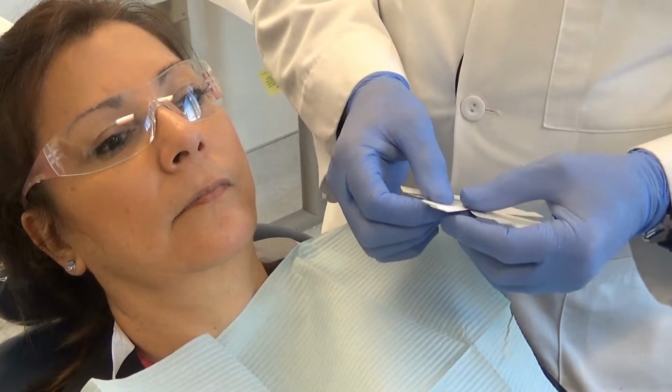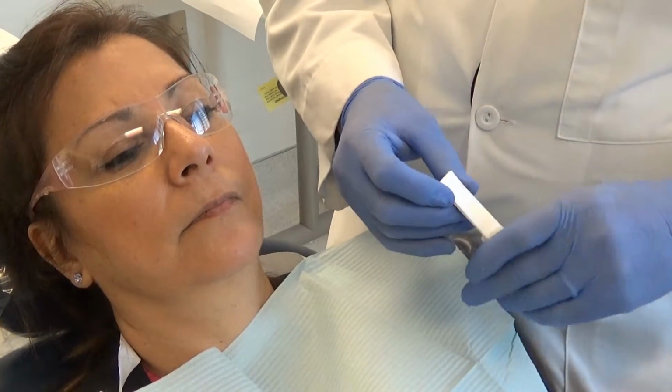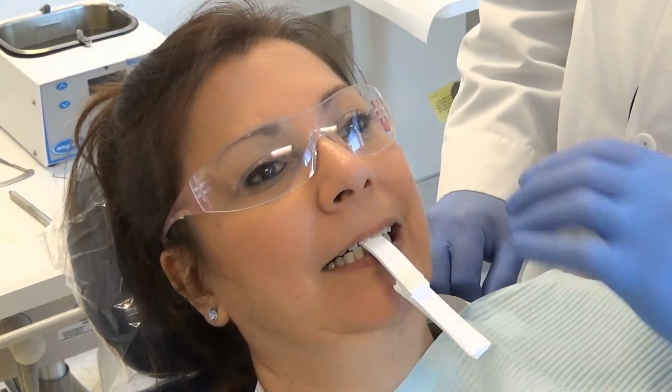So what you're going to do is you could put several of them together on an angle. Go ahead and close on your back. Try to close onto your back teeth and just hold that for me as if you're trying to bite on your back teeth. And what you do is ask the patient if they can contact any back teeth. So do you feel like you're touching any of your back teeth?